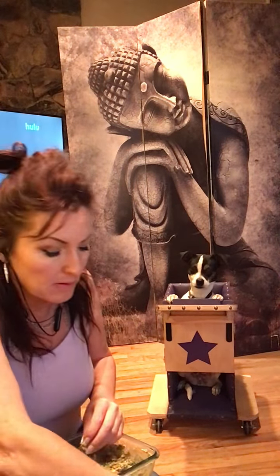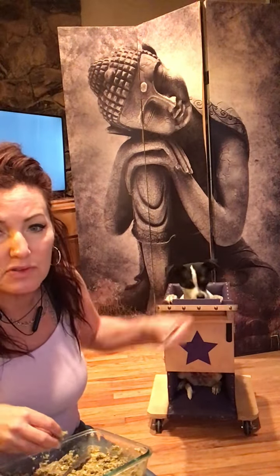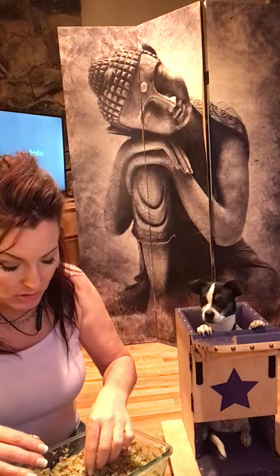But anyway, there's plenty of food here. I'm going to sign off, but basically what I would do is feed her the last amount of food, and then set the timer in the kitchen for 30 minutes. Then I just push her around in the chair. We'll sit on the couch and watch TV for 30 minutes, or I'll clean up the kitchen or something and just wheel her around with me. When the timer goes off, she can get out. And I'm going to withhold water for about 2 hours and try to restrict the amount of water that she drinks. That really helps to keep as much of the food down as possible.